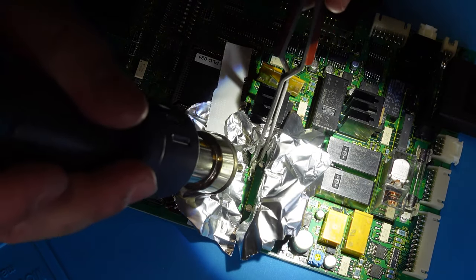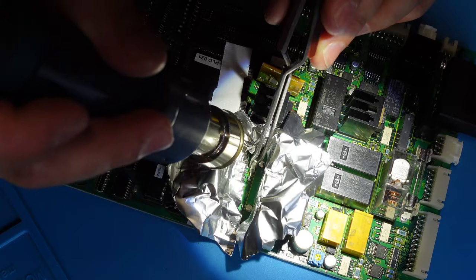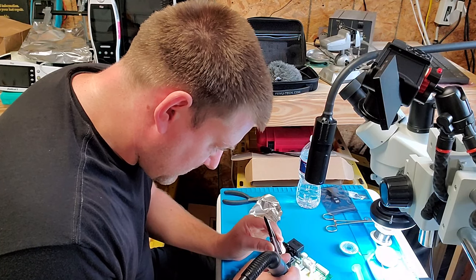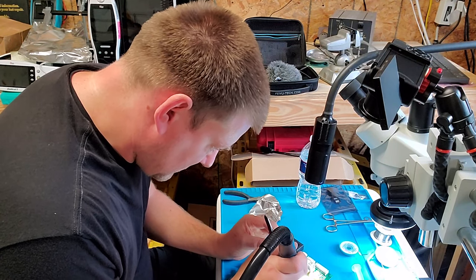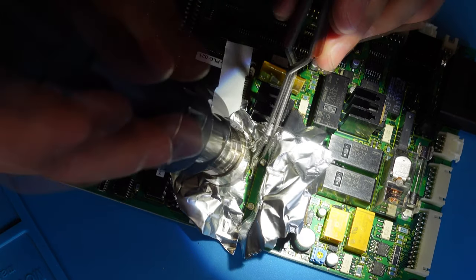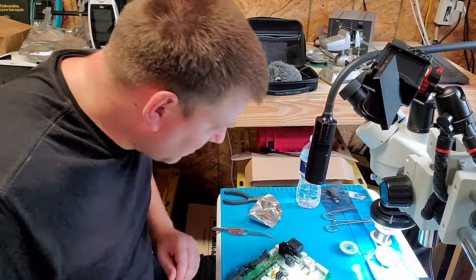I've got the tweezers on the fuse. I could have probably got this guy with the soldering iron itself, but okay, there's one side starting to come. Mind you, I'm not pulling on it. There we go. Okay, so that's the fuse. Let's put that guy back in its dock and let it cool back down.